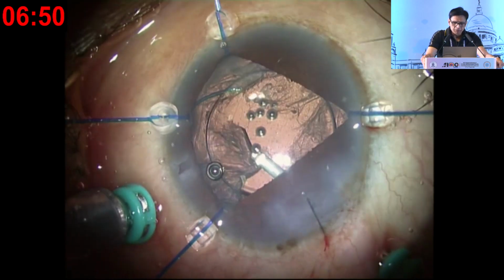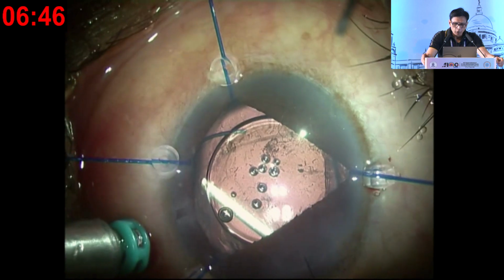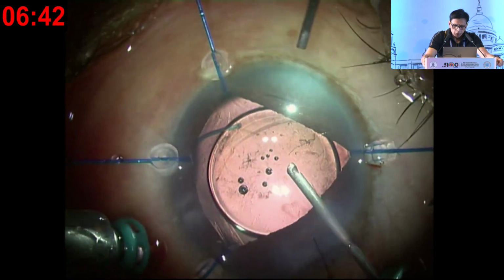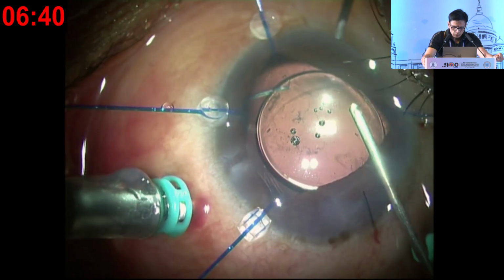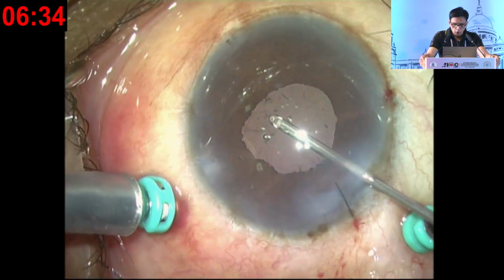So obviously there is some vitreous present there, and at the same time, the vitrectomy probe, I'm going through the pars plana, and I'm going to utilize the vitrectomy probe to clear it up. A very nice thing which was shown to us by Vasavda group was how it is beneficial to use the pars plana route, which I use a lot anyway.